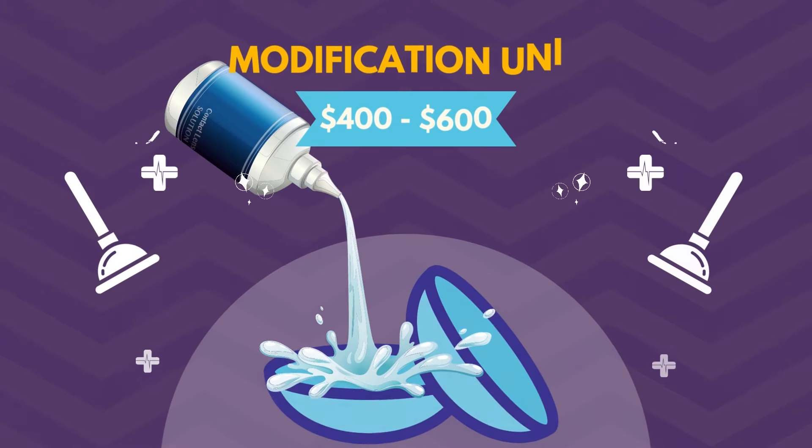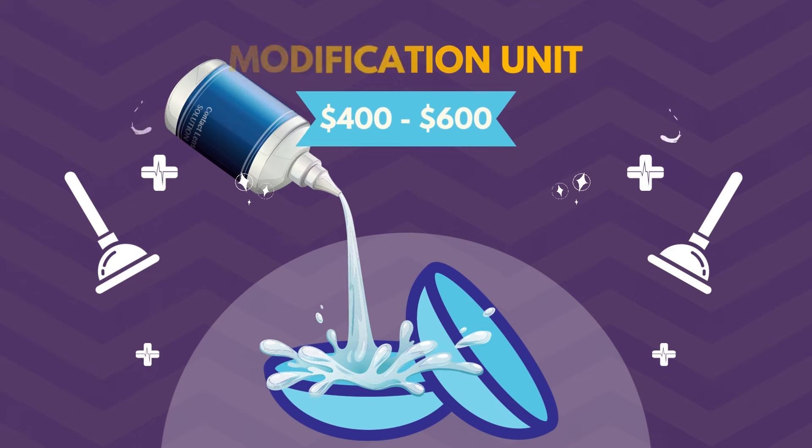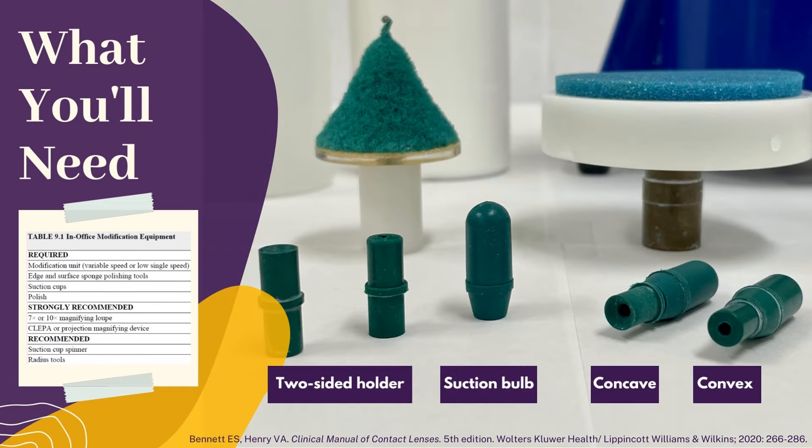A modification unit with all the included tools is quite affordable. It's a useful fitting problem solver, making quick changes to troubleshoot and improve patient comfort without waiting for a new lens. Here's what you'll need to get started: a modification unit, which consists of a motor-driven spindle, metal or plastic bowl, and the accompanying sponge tools. You'll also need some suction cups or greenies, water, and polish.